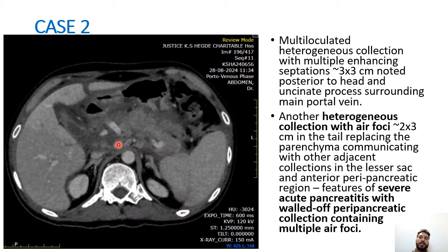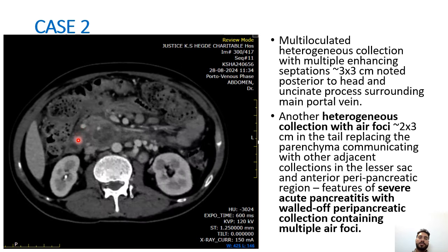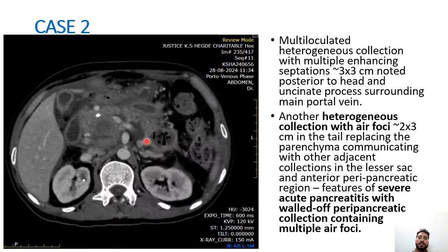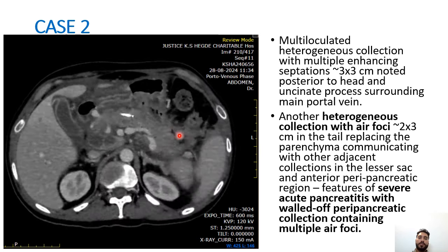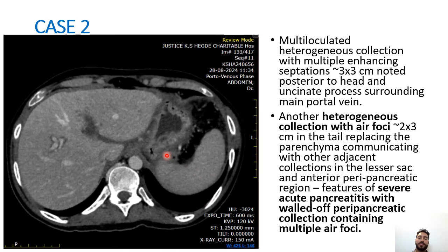A multiloculated heterogeneous collection with multiple septations is noted in the head region. Another heterogeneous collection with air foci is noted in the tail region, replacing the parenchyma and communicating with other adjacent collections in the anterior peripancreatic region. These are features of severe acute pancreatitis with walled-off peripancreatic collection containing multiple air foci, representing an infected collection.